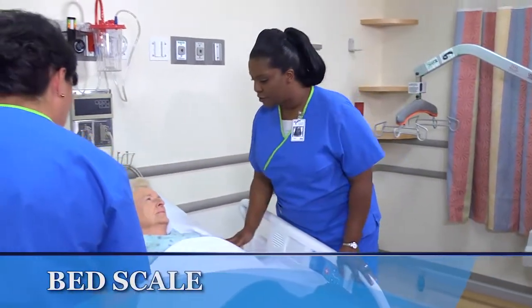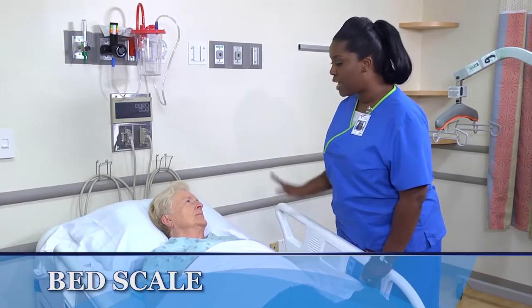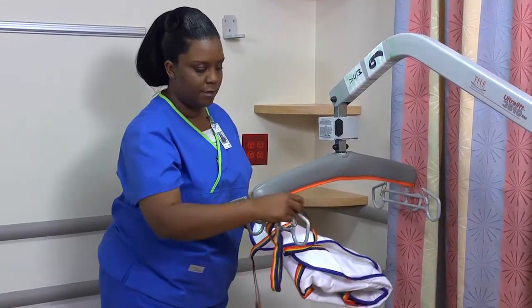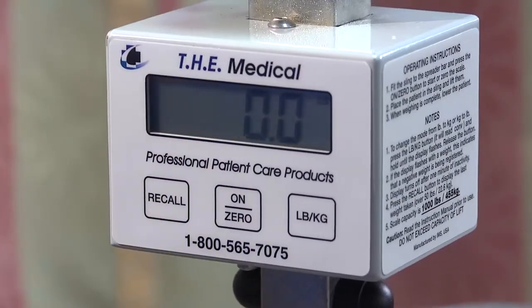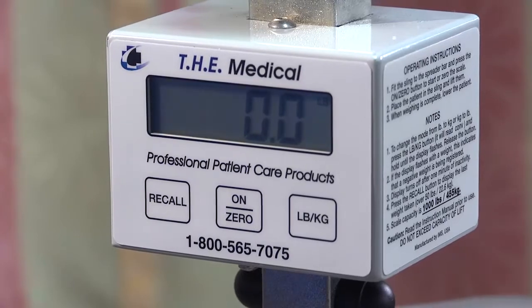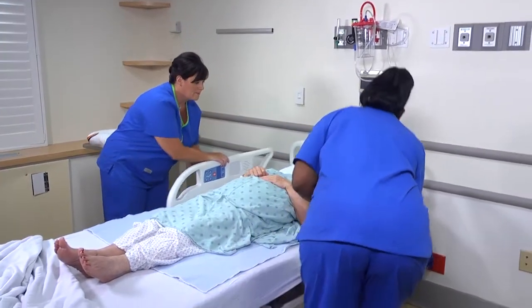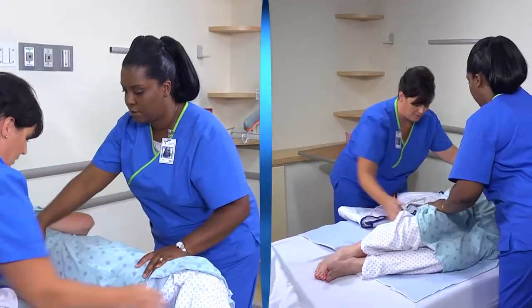If a bed scale is used, you will need to discuss the procedure with the patient and calibrate the scale. Place the sling on the arms of the scale and calibrate the scale to zero. After you obtain the reading, remove the sling. Roll the patient onto one side and place the sling beneath her. Use good body mechanics and get the help of an assistant.